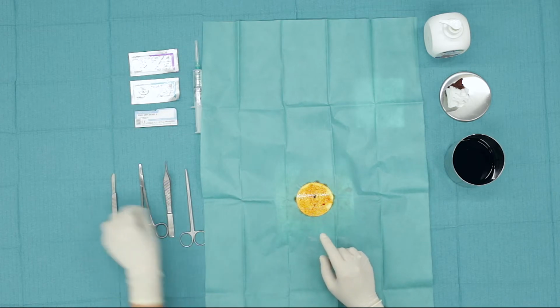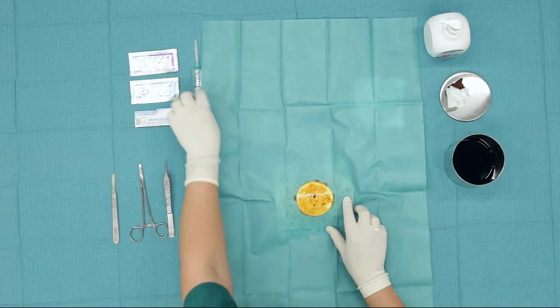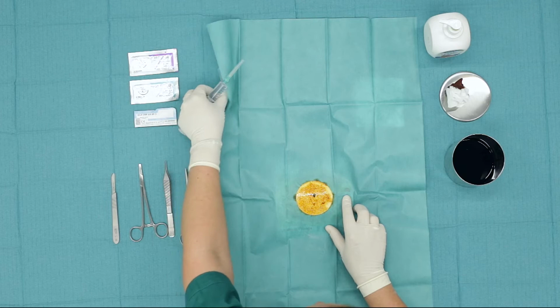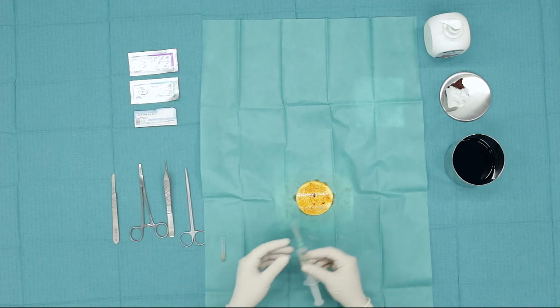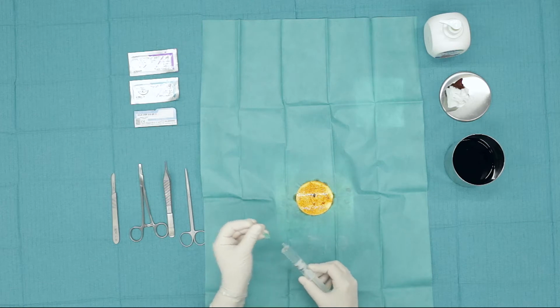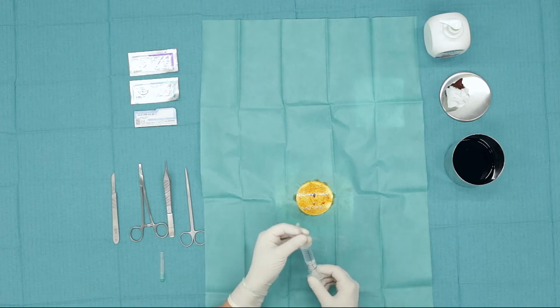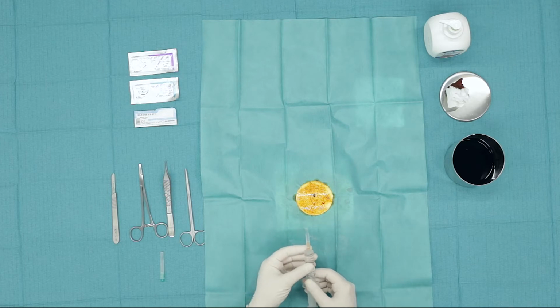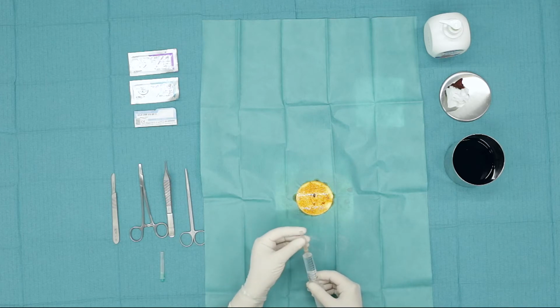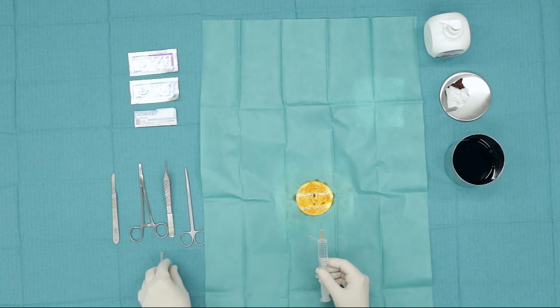Before proceeding with the removal of the formation, I must also do local anesthesia. The local anesthetic is usually xylocaine, which you put in a syringe. To give xylocaine to the patient, I must ensure that he does not have any allergy to the preparation. The simplest question is whether he has done any dental work in which local anesthetic was used, and then a thinner needle than the one with which I took the preparation from its packaging.